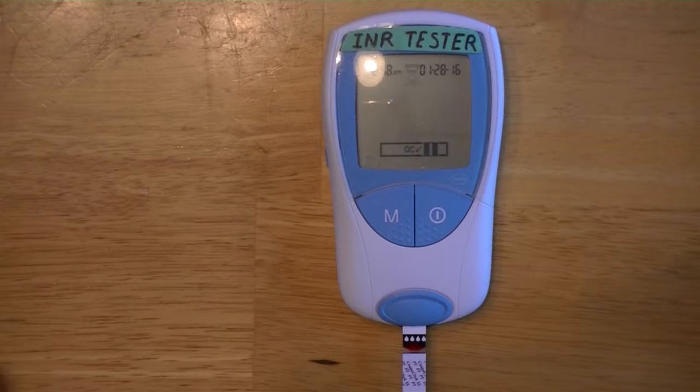Now the machine sucks the blood up into it and will give me a number telling me what level my INR is. I'm going to have to call that into the machine, which will report the results to my doctor sometime tomorrow. This takes anywhere from about 20 to 40 seconds depending on battery condition.